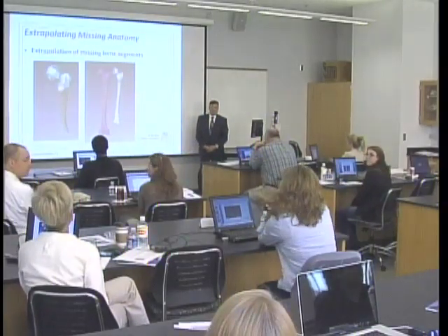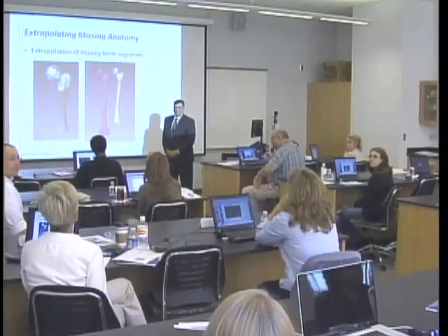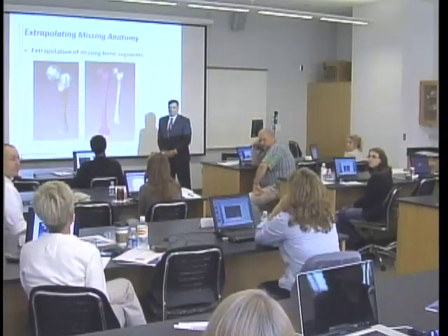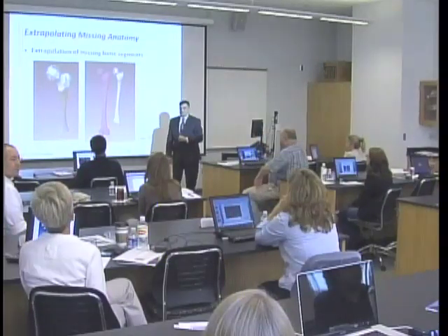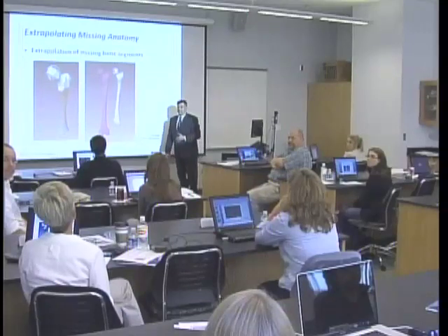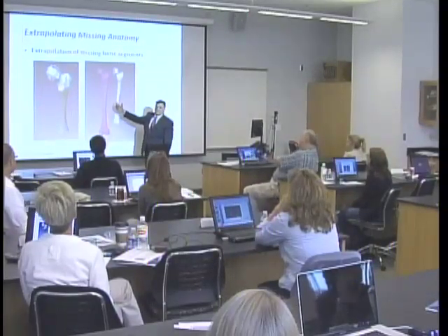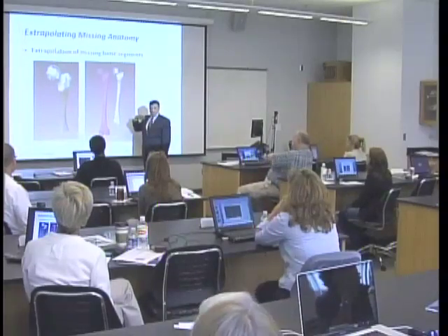So Mohammed, on this one with the femur, what equation did you use to determine 5'2"? I used the best equations, the same equations as in the morning, exactly. So you get a range then, not just an exact stature. Yes, it was a range. What we did is we came up with the length of the bone and plugged it into the equation. So I'm not working on stature prediction; I'm using the existing equations, but we are predicting the 3D structure.